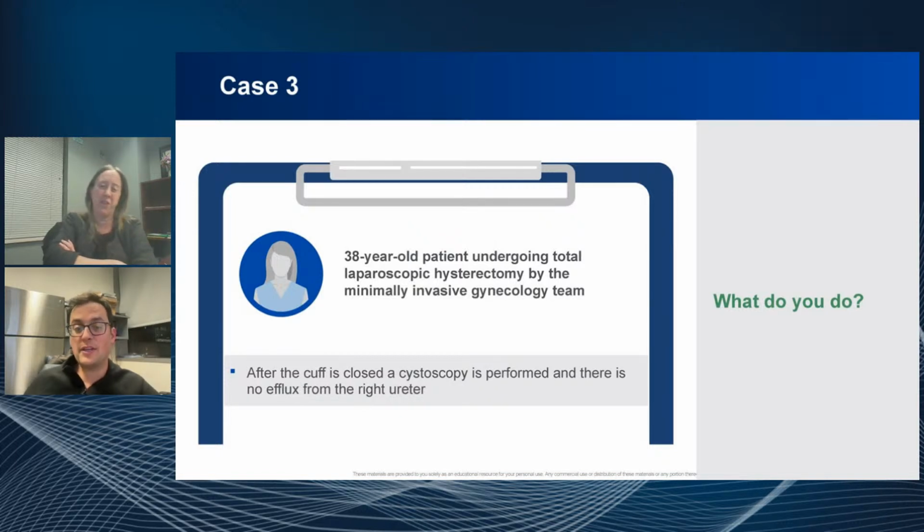Yeah. So I was going to say, even having given the agent, if it's not effluxing, and then you take the stitch out or you do something, and then all of a sudden you see it, it's a much quicker, more surefire way of knowing that you did the right thing. Okay. So at this point, I think we are hopefully not going to need a stent. You remove the stitch and you had efflux of some nice blue.